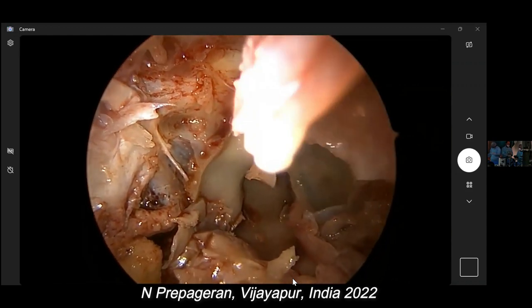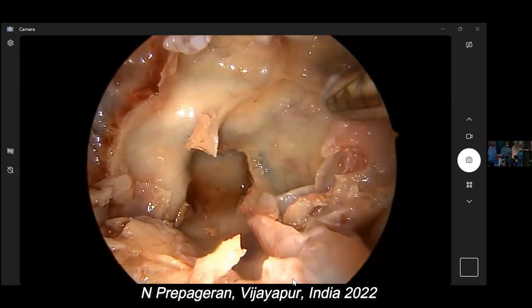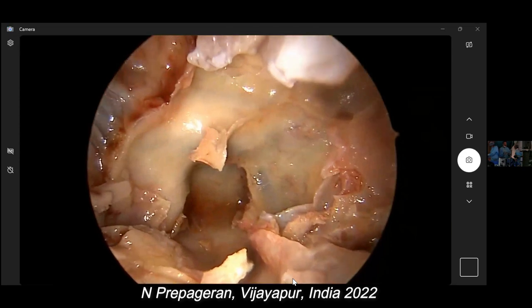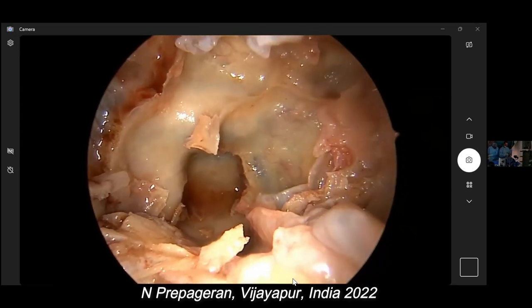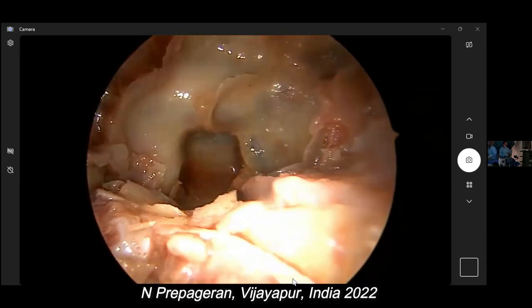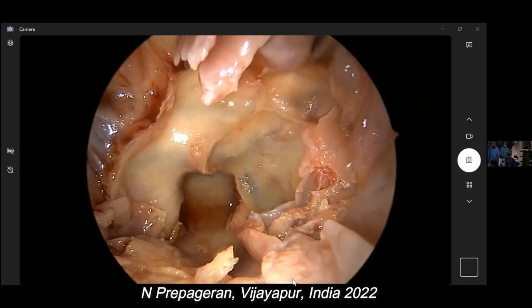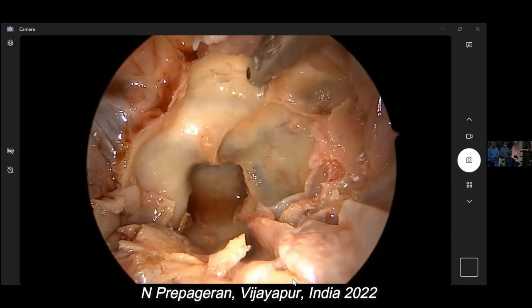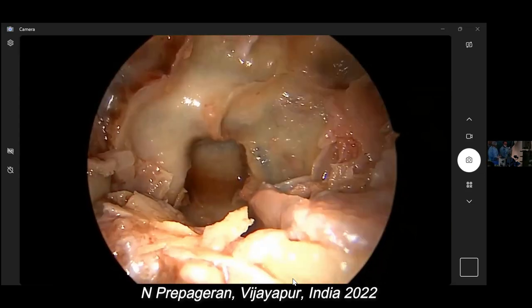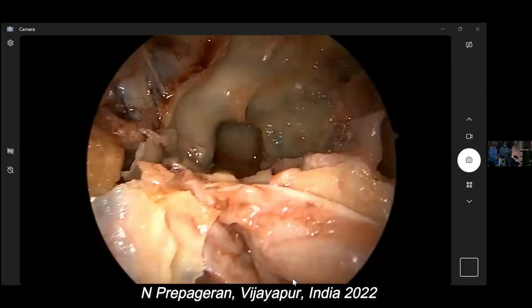Hey, we're blocked, guys. And the OCR is on top there. This is another Onodi cell. So you have a bilateral Onodi cell. How did they pick up such a lovely case like this? Please clap for Shashi and Madam Professor Lakta. Can you see what I meant? Look at this. Look at that. OCR on both sides. Divider again.